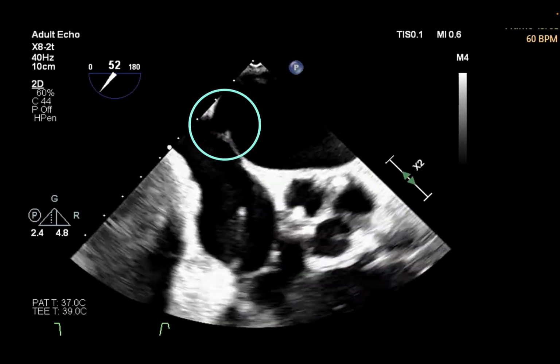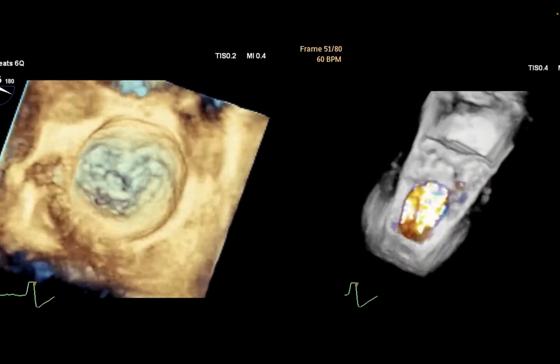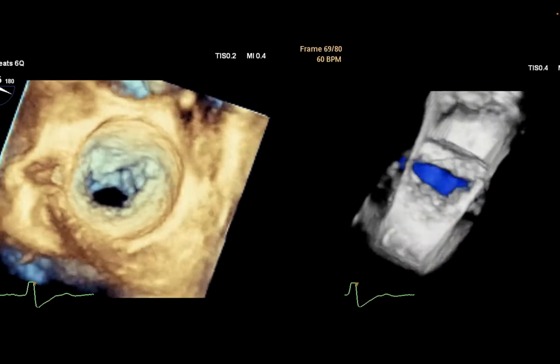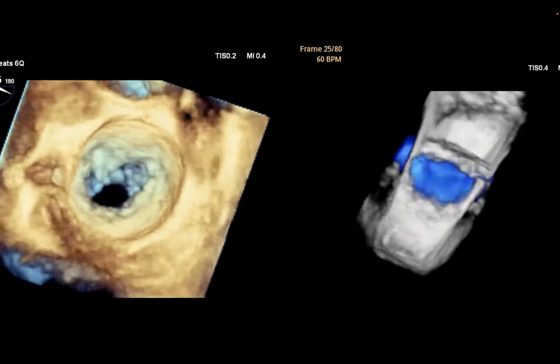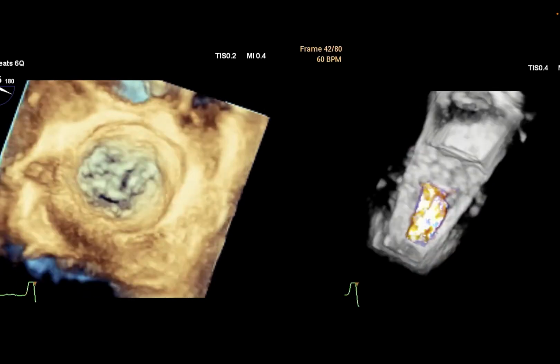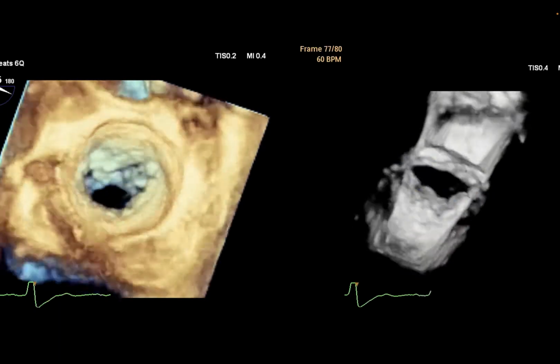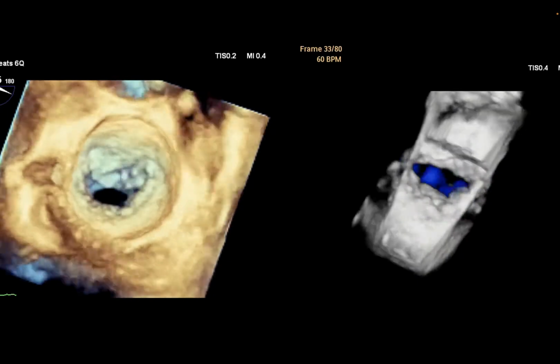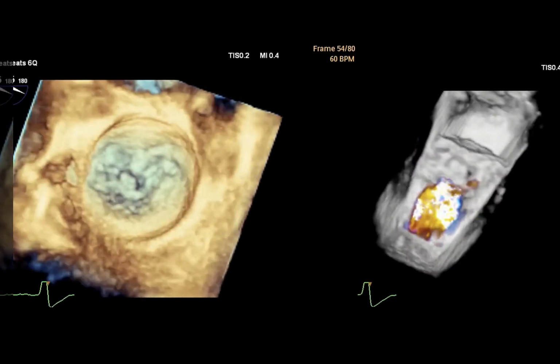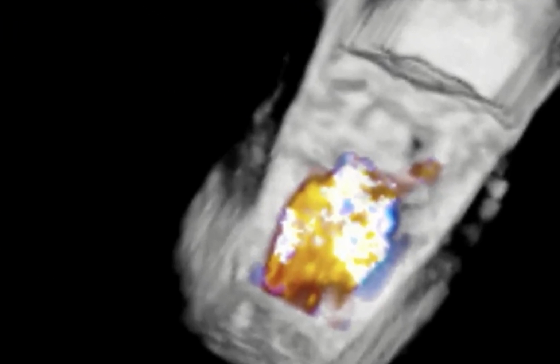But anyway, we went ahead and took a look at his mitral regurgitation. As you can see, this is a central mitral regurgitation, which is directed posteriorly, a very broad jet. Anything you want to know about this, Aidan? Yeah, so this jet is very much in keeping with ischemic mitral regurgitation. As you said, it's a very broad-based jet. The other thing that comes to light viewing this is that I'm looking at the A3 scallop area. Is that a perforation, or what are we looking at?